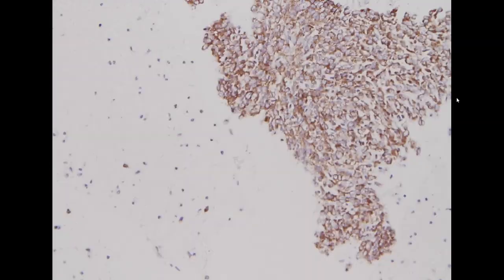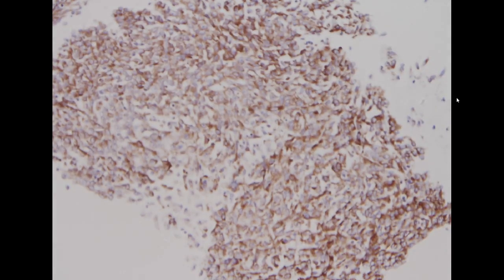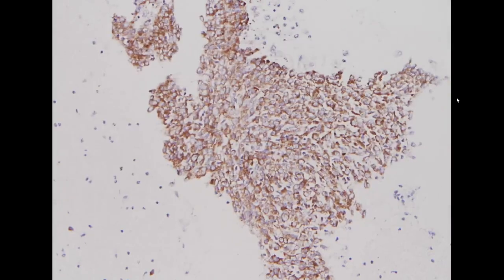So our final diagnosis is Milan category 6, malignant. It is a high grade carcinoma, compatible with myoepithelial carcinoma.